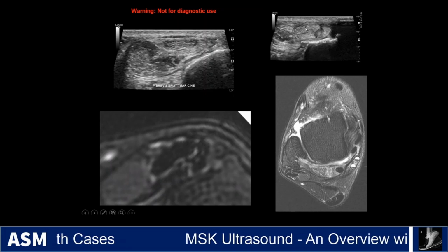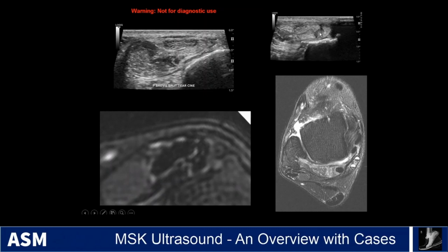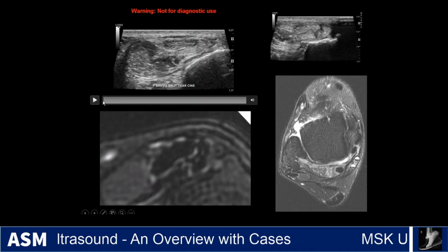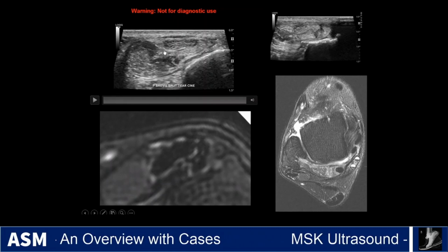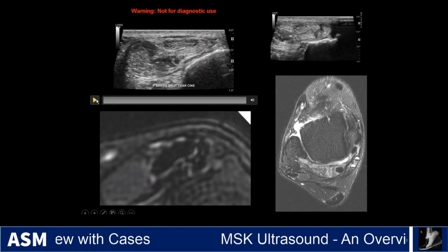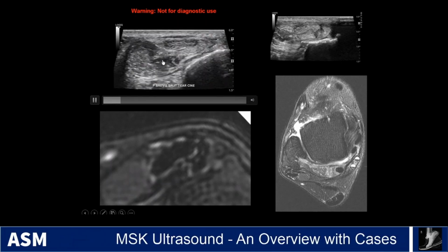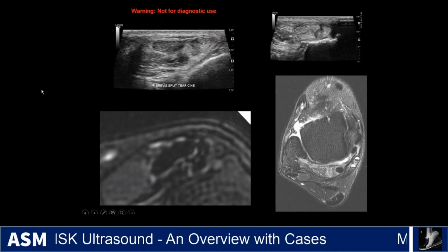Here is the peroneus longus, the brevis muscle right here, and the split brevis here up against the back of the fibula. And when we had the patient move their foot around, we could dynamically see this snapping tendon, because they presented with a snapping tendon that was torn. And so if you watch, here is the peroneus brevis, here's the longus, and when they move their foot around, you see it snapping past and then splitting apart that tear there. So I'm going to play this again, and you see it snapping past the tendon with this split becoming readily apparent.